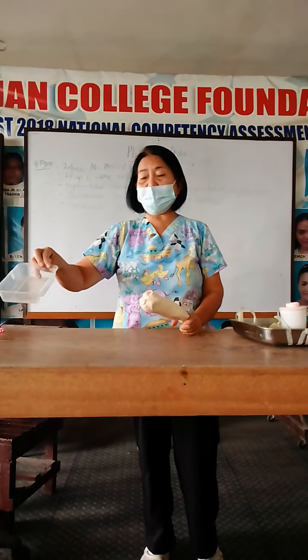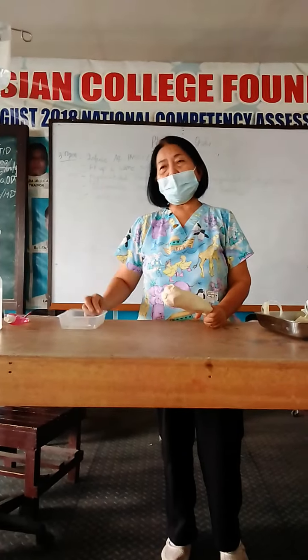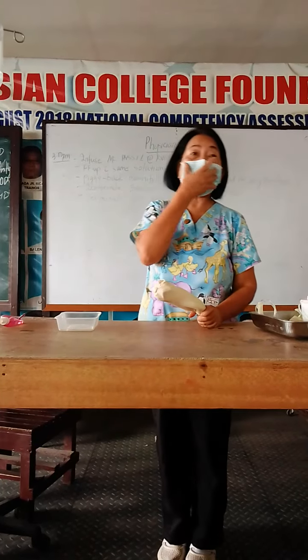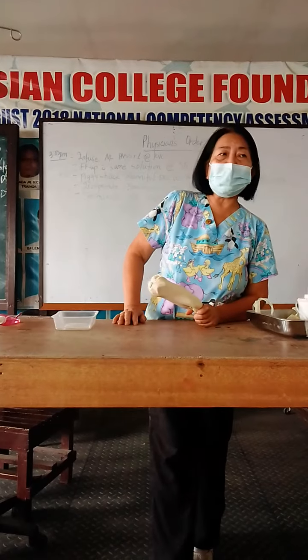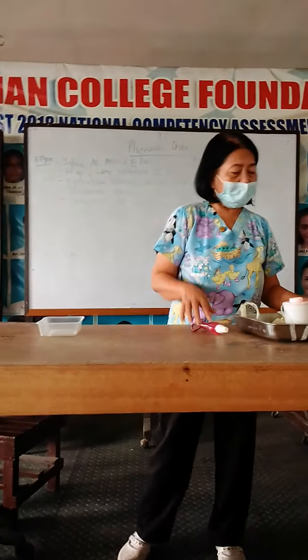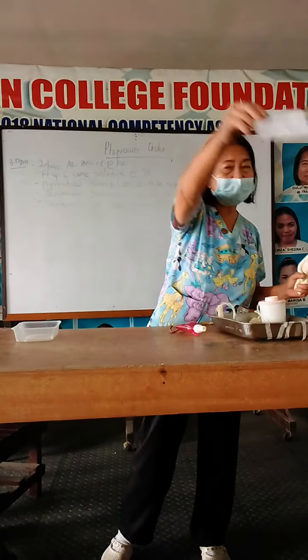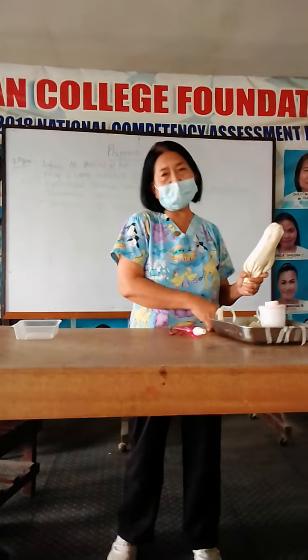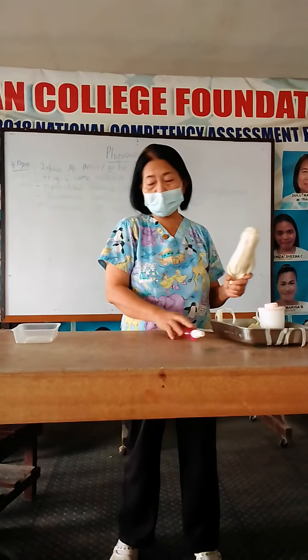Because when I prime, there's the water there. So, every item that you will not use anymore, you have to put immediately in the kidney basin to maintain the orderliness and cleanliness of the area. Okay? So, of course, IV tag, which will be filled up after insertion.